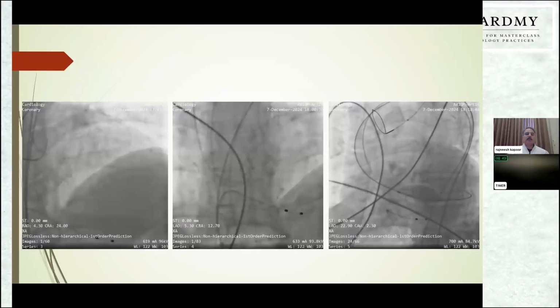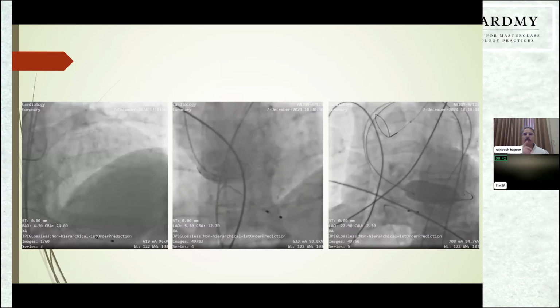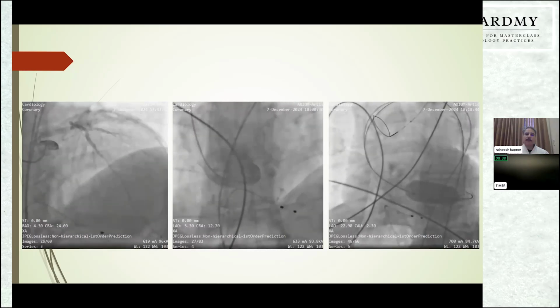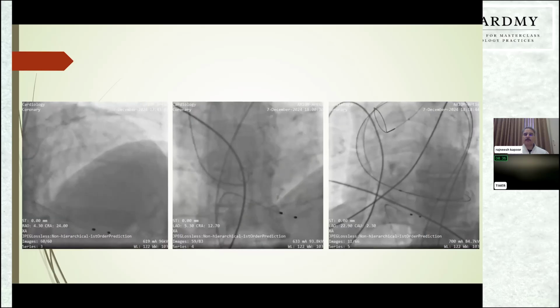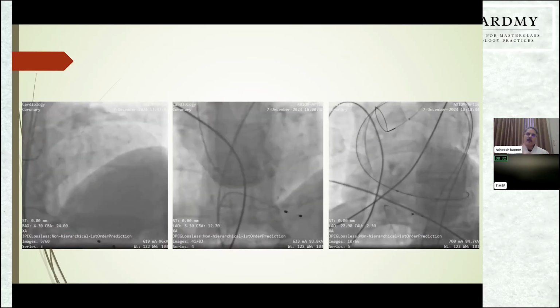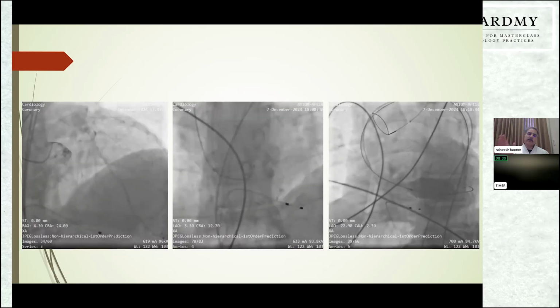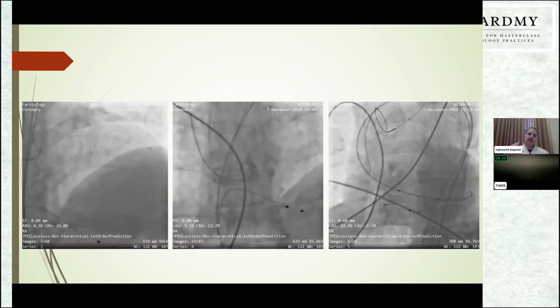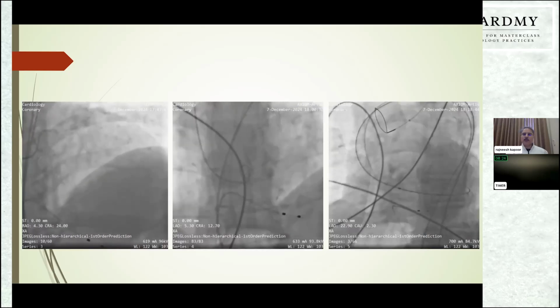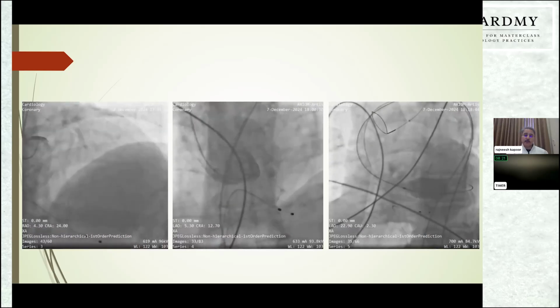So this is the problem, and especially if you are doing a calcified bicuspid with angulation like this and ascending aorta dilatation, then plan prior that you take the help of a snare. We were anticipating this based on our earlier experience, having done more than 300 cases; we know that in these cases we will face a big difficulty in pushing the valve across the aortic annulus.